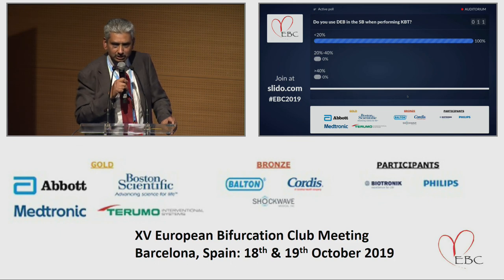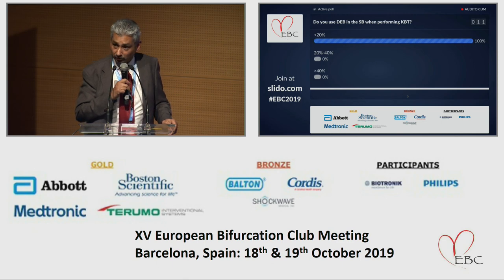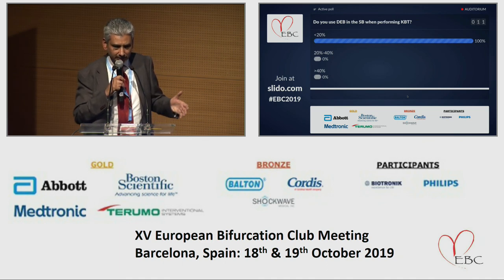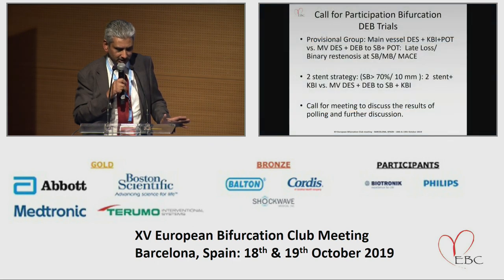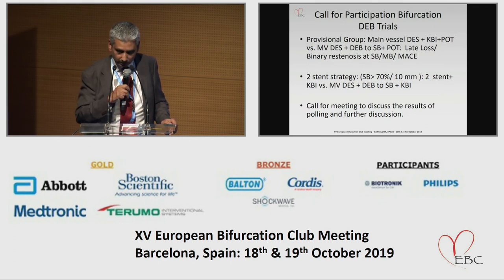Okay, so these are the questions. I think to summarize, obviously there is a potential role for a drug-coated balloon in large side branch in provisional bifurcation coronary artery stenting. Could you put up my last slide? Obviously my colleague has already discussed the different bifurcation DCB trials which could be proposed. And there are different combinations, whether in the provisional group you use main vessel drug-eluting stent followed by KBI as standard, or in place of kissing balloon inflation, you use the drug-coated balloon in the side branch.